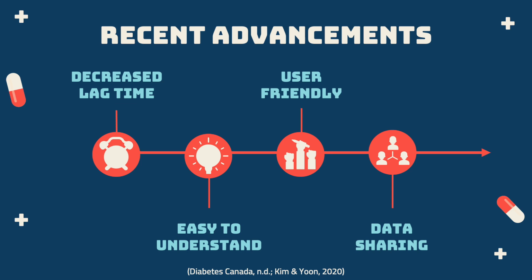Although very few continuous glucose monitors have decision-making capabilities, some of their sensors can be linked to insulin pumps that tailor dosing based on demand, mimicking the metabolic processes of the pancreas. These sensors track and store glucose trends over longer periods as well. Trends can then be uploaded into an app that patients can share with their care providers. Having ongoing information readily accessible to the patient and provider improves diabetes self-management and allows for timely adjustments to medication, food intake, and activity.